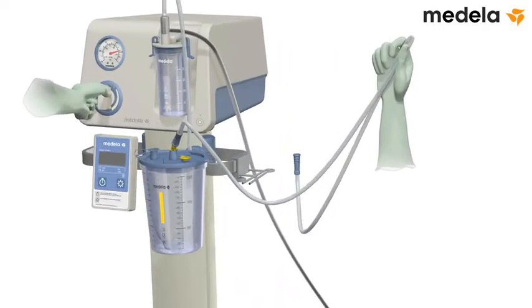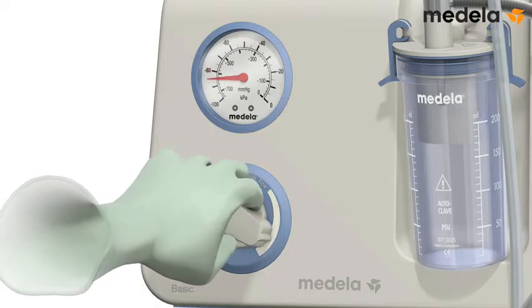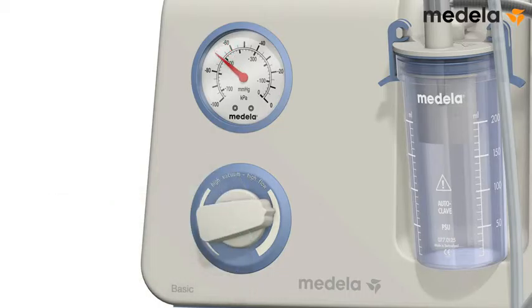Set the pump to the required maximum vacuum. The recommended vacuum level is between minus 60 and minus 80 kilopascal. This is equivalent to minus 450 and minus 600 millimeters of mercury.